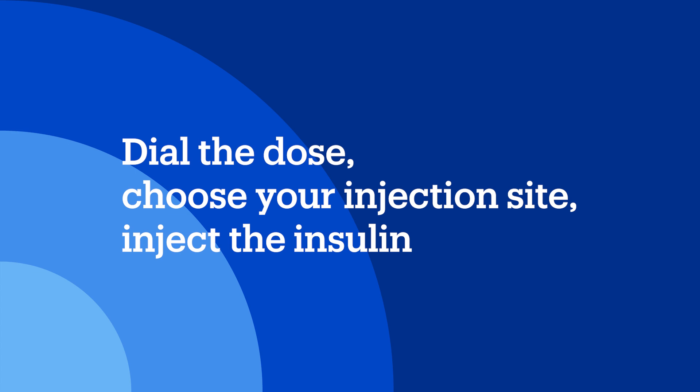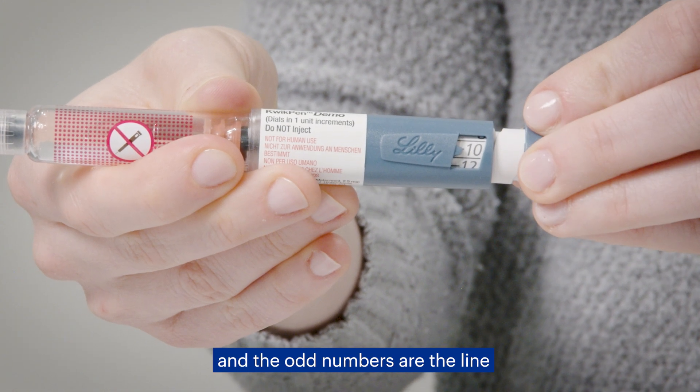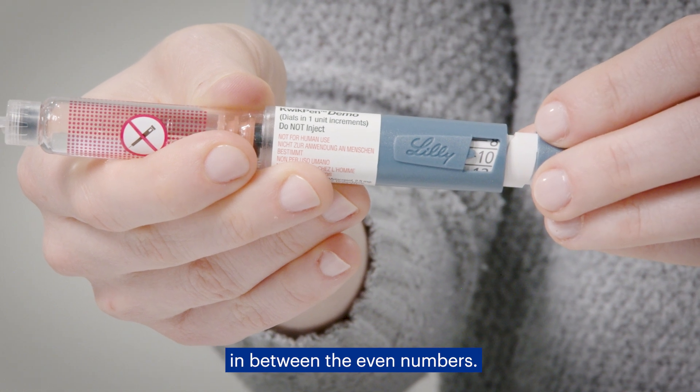Dial the dose, choose your injection site, and inject the insulin. Now you'll be dialing to your dose. Make sure the arrow is lined up with the dose you're injecting. The even numbers are labeled, and the odd numbers are the line in between the even numbers.